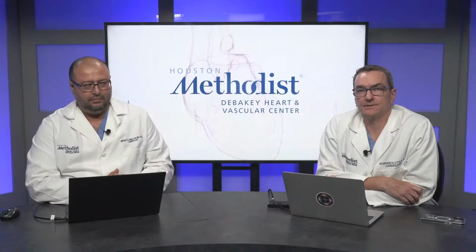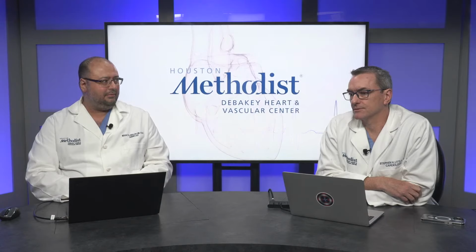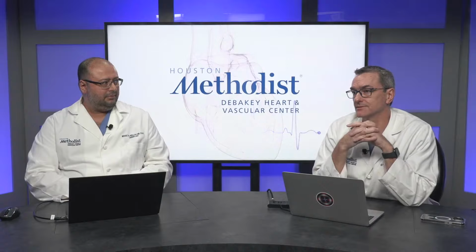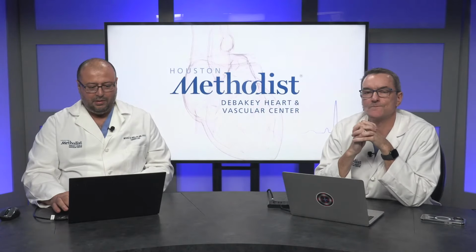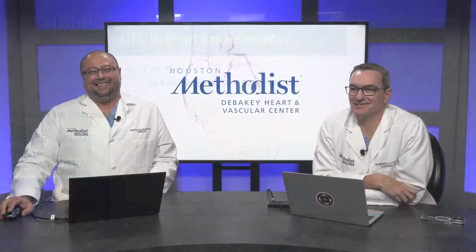Thank you, Dr. Al-Mallah. That was, as usual, excellent. Quick question for you. In your early slides, you commented on the sensitivity and specificity of CT for the diagnosis of endocarditis. What was the reference standard? So there were multiple. If you remember on that slide, let me maybe bring it back. There were multiple reference standards used. So here, CT using TEE as a gold standard. That's good enough right there. We can stop there. That's all I needed to hear. That's all you needed to hear? The President-elect of ASNIC, TEE standard.